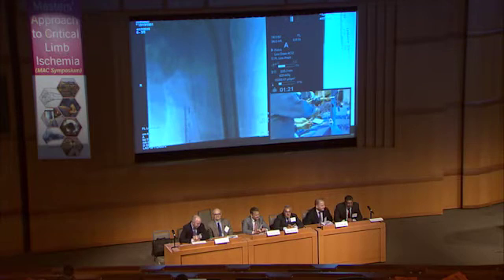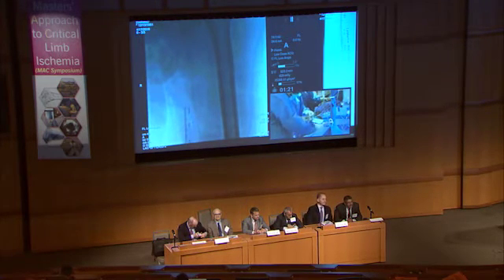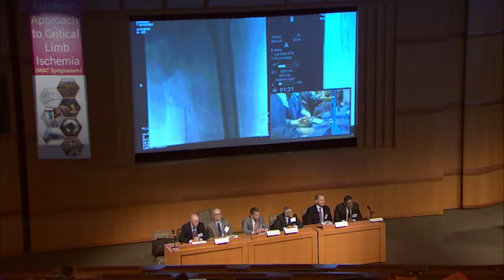So what kind of balloon did you use? I think you used a 5.0 balloon. So are you going to IVUS it, or are you going to add some cost? I see Dr. Burkhardt nodding his head. Not yet, but I think he might accept that charge. How are you going to size your Viabahn, or have you already pulled it out of the bag? I have a 6 here, but I agree with you.